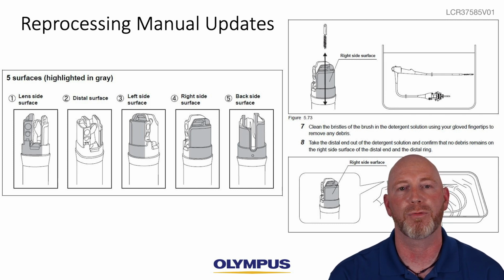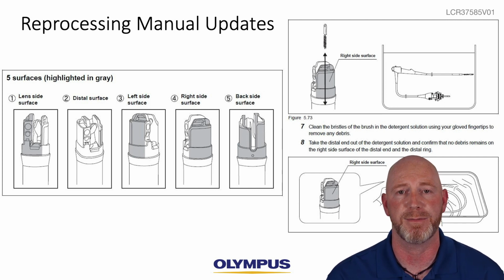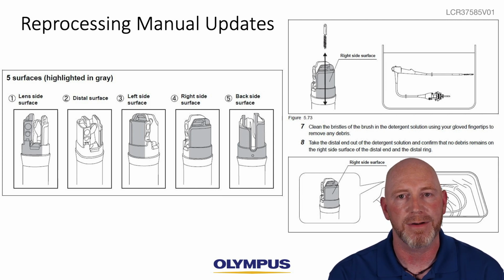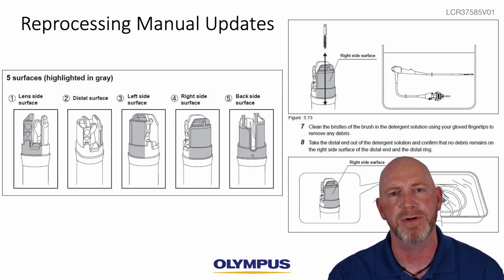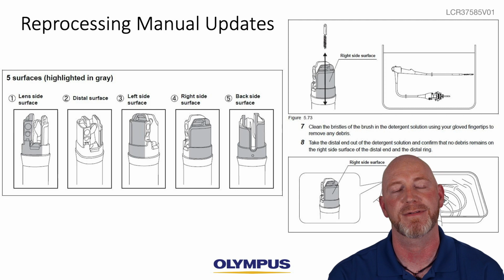What we did before writing this reprocessing manual was take what we learned from the human factors study performed for our other ERCP scopes. We took feedback from you, the end users, and we made the manual easier to read, understand, and execute. The steps are more clearly written out, so it may appear as more steps, and it may seem like it is a lot more pages, which is actually true, but that's due to the amazing pictures that have been added to help guide the user through the process.